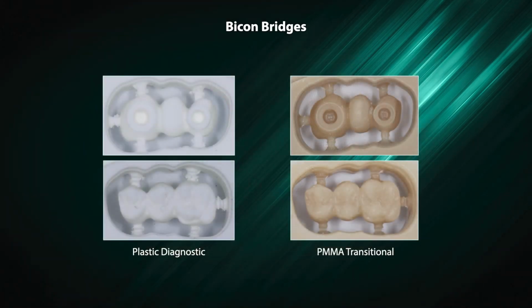On the left are Bicon plastic diagnostic bridges, and on the right are Bicon PMMA transitional bridges.